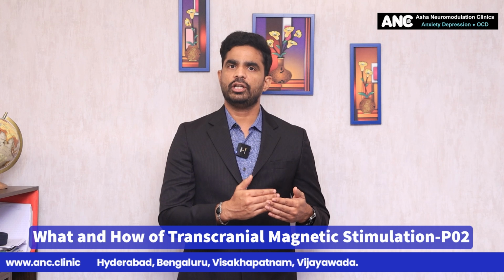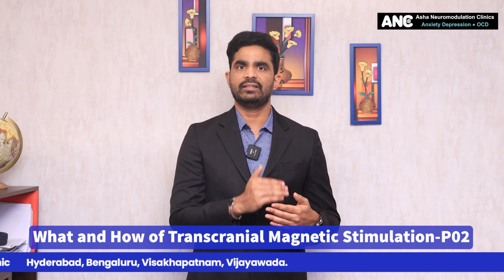So let us briefly sum up today's session. What we have learnt is the classical and the non-classical effects of the TMS on the brain tissue. The classical effects involve the effects in the primary area, like for example changing the membrane potential or the electric behavior of the cells in that area, and also, by means of action potentials, secondary effects in the distant parts of the brain.